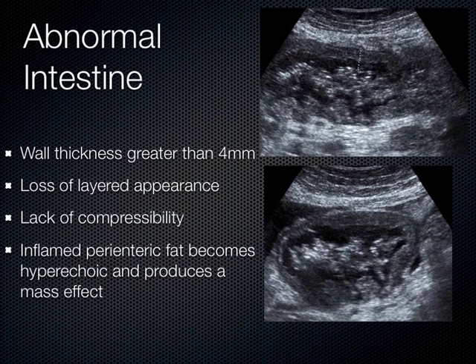Now, as you can see here, this is abnormal intestine. How do I know that? Well, I measured the wall thickness. We measure from the outside edge of the wall all the way down to where the lumen starts. And this is where the lumen is here. This is like stool and feces and a little bit of air. These little punctate things here, that's probably air. Whenever I see dots on the screen, those are almost always air. And so the wall actually extends right to where the lumen starts, okay? So over here, the wall would start here, all the way down to where the lumen starts. In fact, down here, the lumen starts right about here, okay? So this is abnormal when we see it thickened like this.